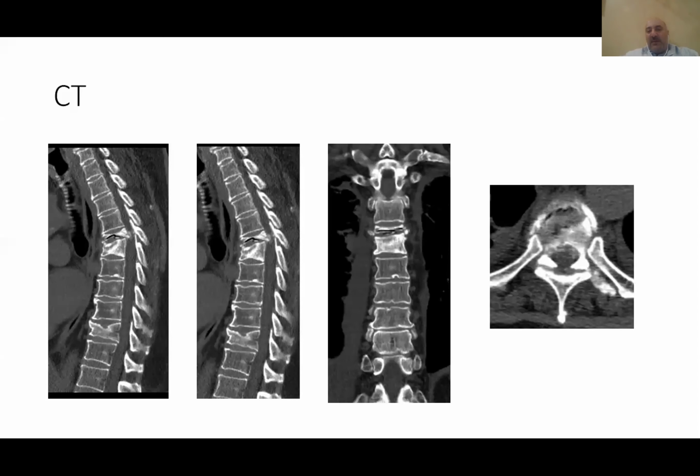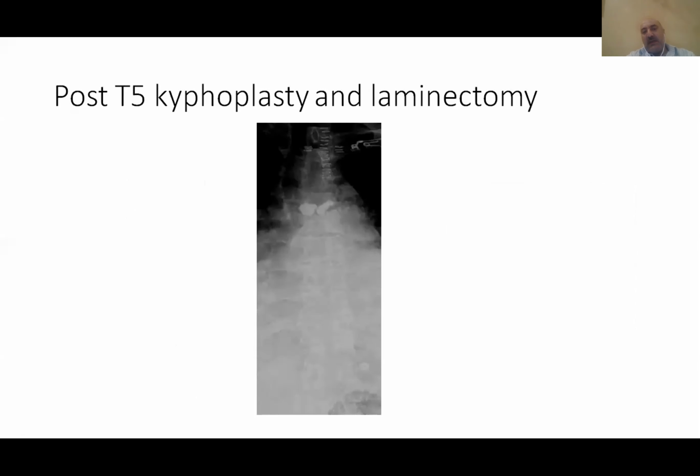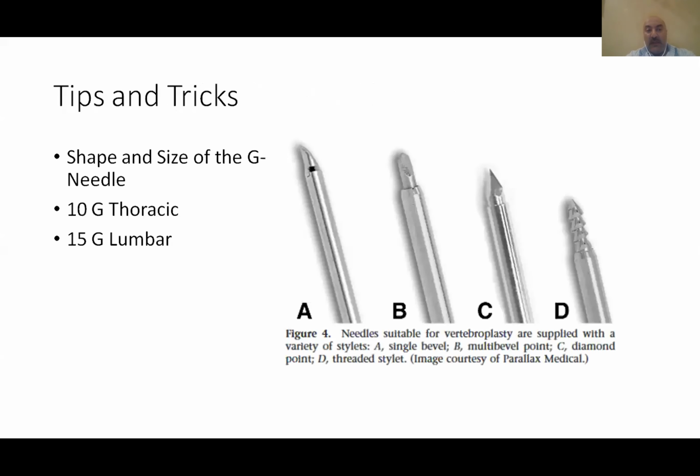I did decompression here. I didn't go deep to touch that piece from the vertebra, the one that's pushing. So just laminectomy was really enough, and you can see the cord was pulsating. There was no active pus or infection that I saw, so it gave me more encouragement to do kyphoplasty at that level. And it seems to me it worked. This guy is doing well. He started to improve after the surgery, and he went home now. I hope that he will not catch infection, because it would be a catastrophe. I don't want to see him again.